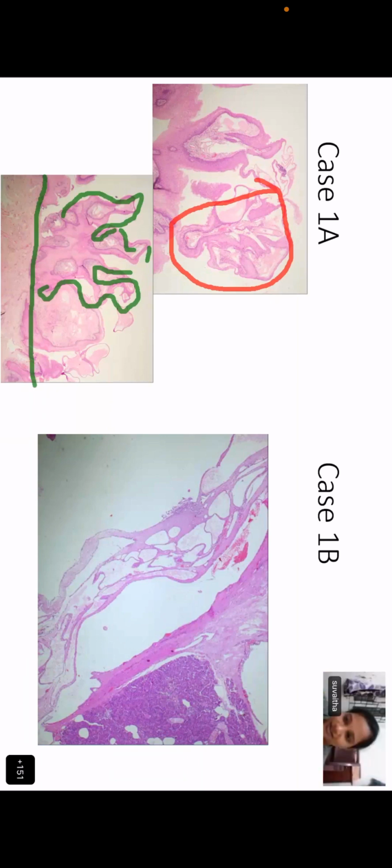All right, so a papilla should have a fibrovascular core in the center, right? Very good. It can be called a pseudo papilla, ma'am, because a true papilla will have a fibrovascular core. Okay, very good. What about you, Vimi?